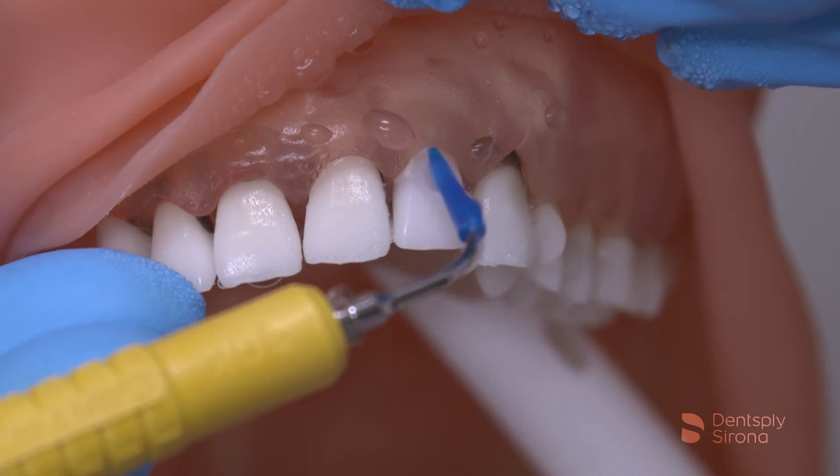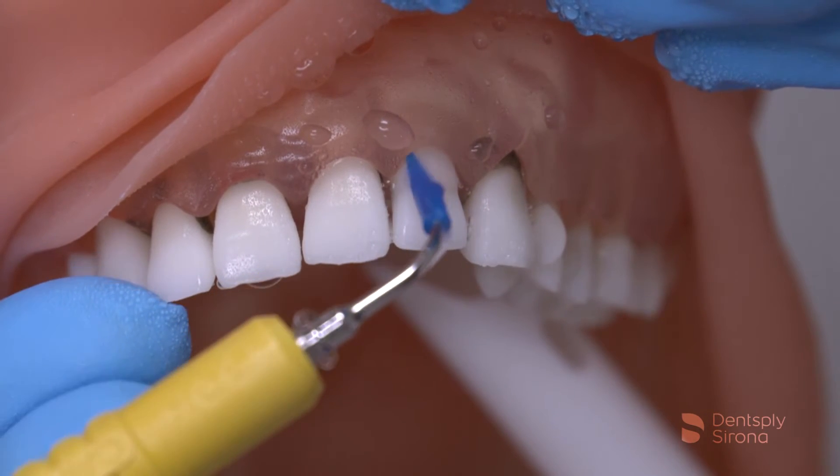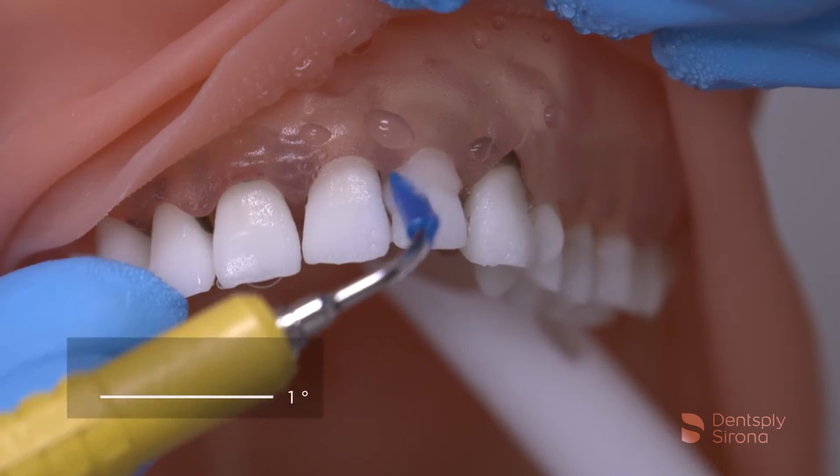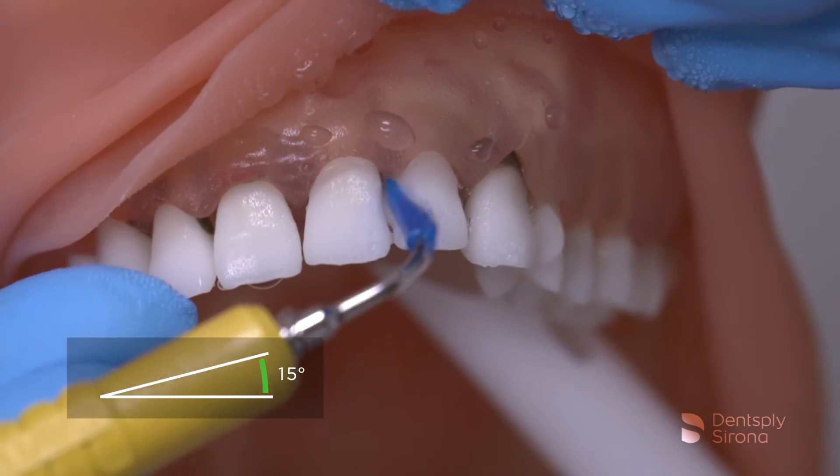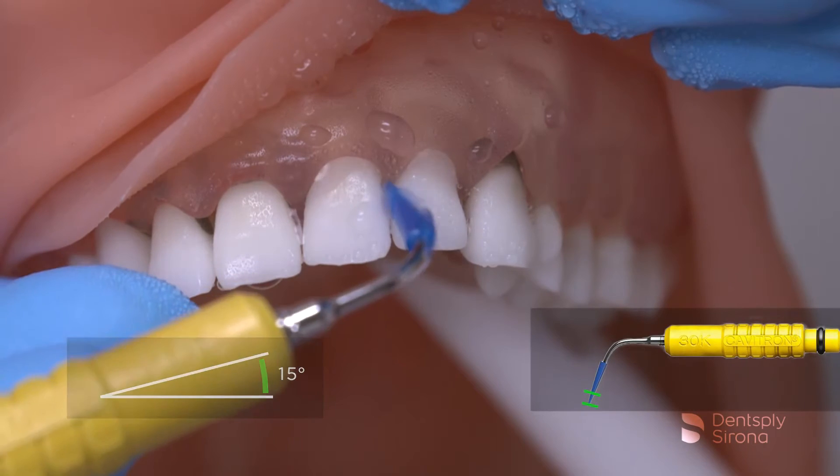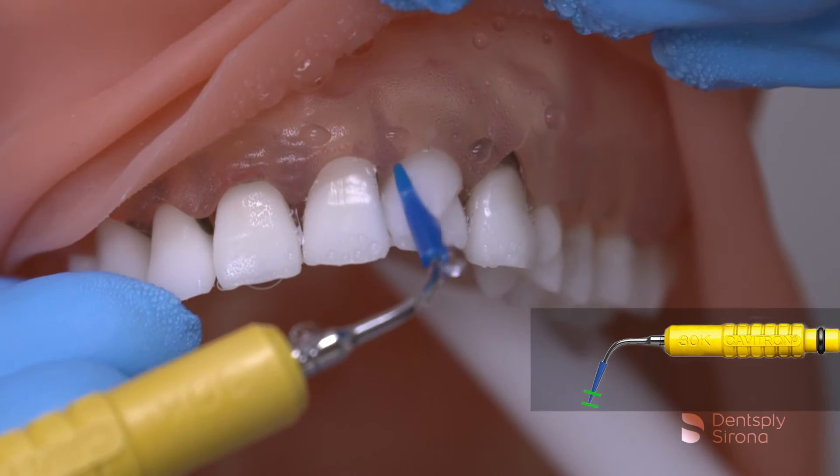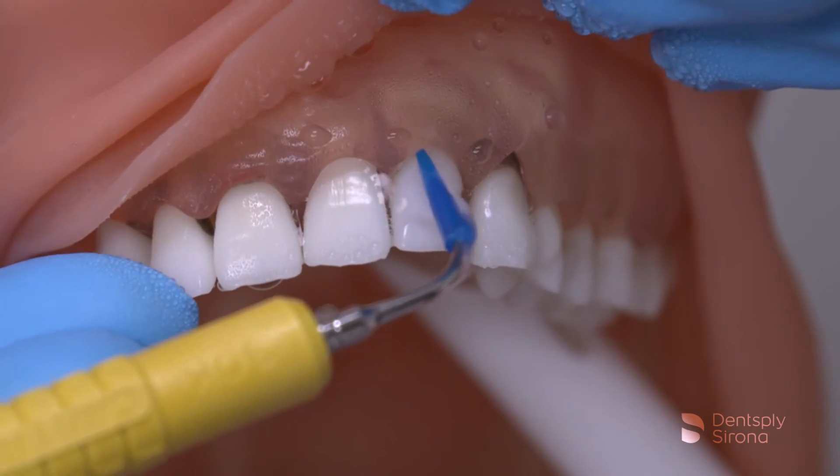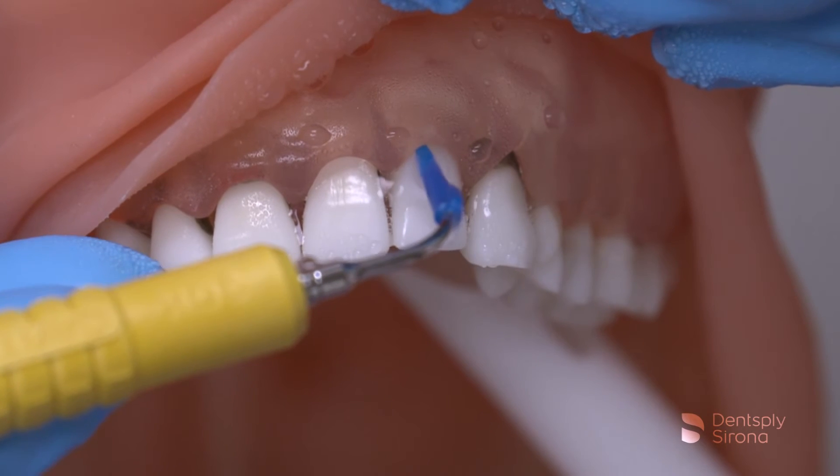The insert terminal end is placed slightly subgingively with a 0-15 degree angulation and 2-3 mm adaptation. Utilizing a 1-2 mm overlapping stroke will ensure thorough biofilm debridement.